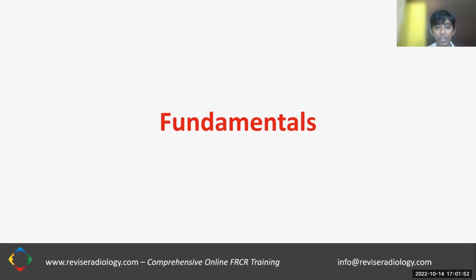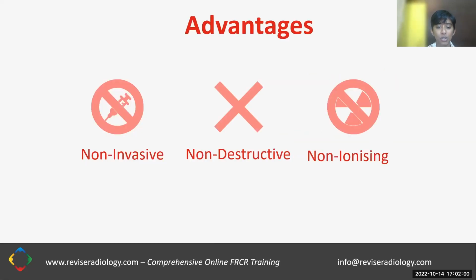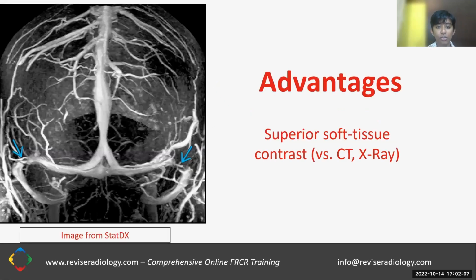We'll be discussing the fundamentals of MRI, including, first of all, what are the advantages? So magnetic resonance imaging is non-invasive, non-destructive, and non-ionizing. The advantages of MRI are that it has superior soft tissue contrast when compared to CT and X-ray.